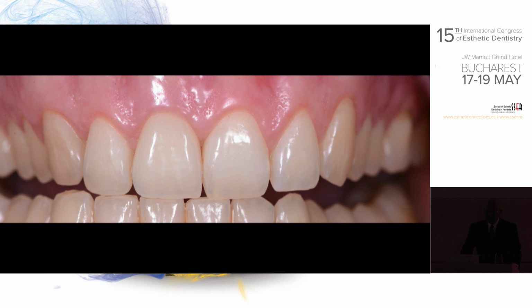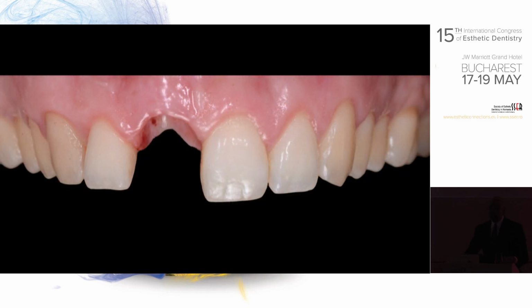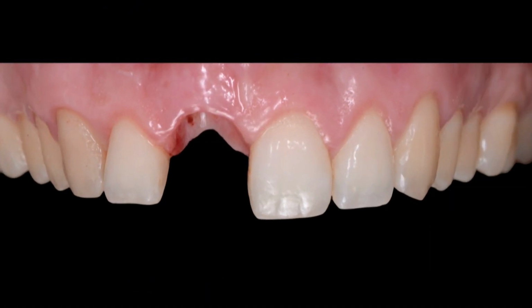The patient came in with a huge inflammation on tooth number 11, and throughout the steps, we treated this patient with an implant.